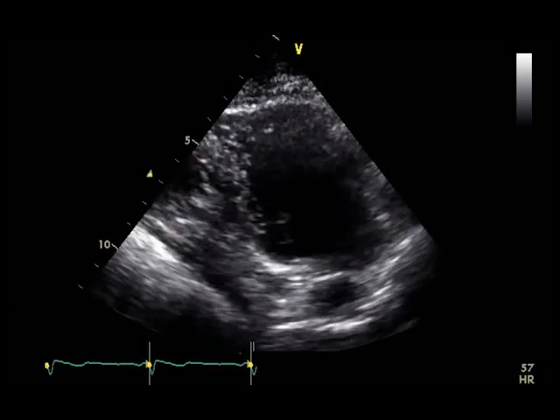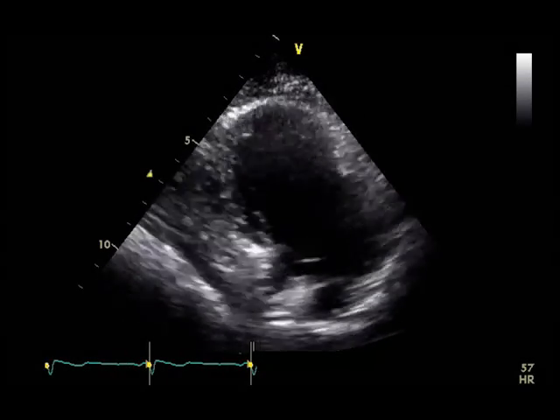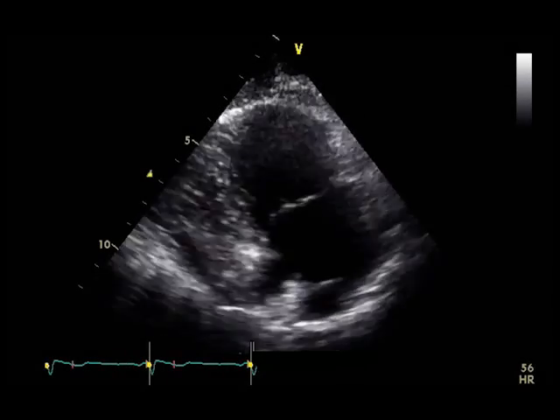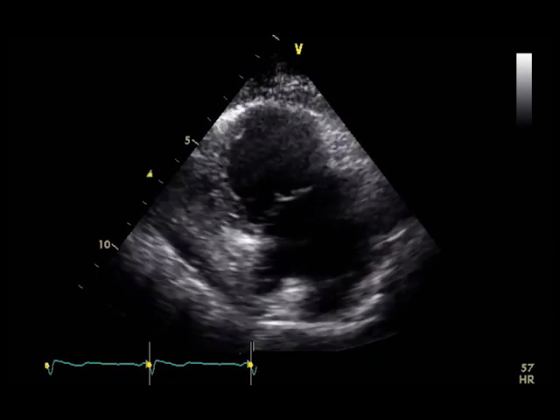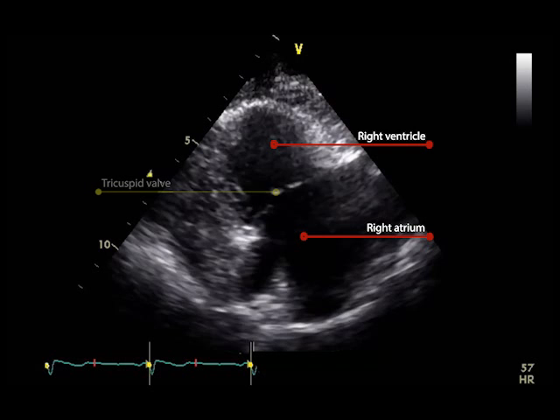This is a parasternal long axis view of the right ventricular inflow tract of a normal heart, which shows the inferior portion of the right atrium and the inferior and anterior right ventricular walls. This view is useful to visualize the tricuspid valve and its anterior and posterior leaflets.